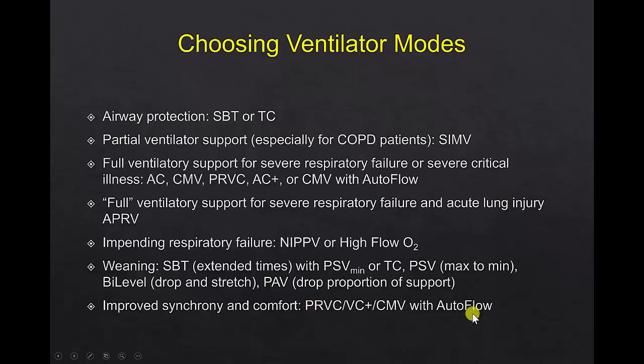But these are the modes that allow us to choose a target tidal volume, but we don't choose the flow pattern, and the ventilator will adjust the pressure to deliver the target value. In my next talk, if you can handle more details, I'll actually show you how these modes take care of dysynchrony and make the patient more comfortable.